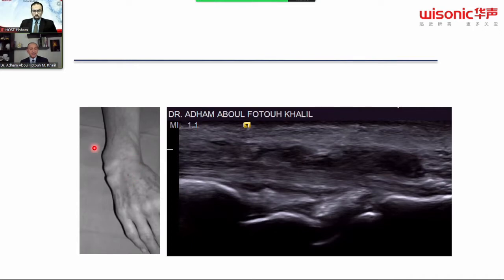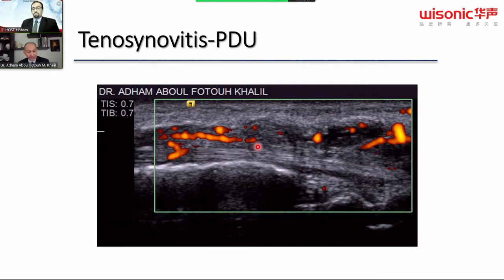This is a patient who might have chronic synovial proliferation of the hands and wrists, and you can see some deformities and some swelling clinically, but it's quite difficult to differentiate which element is taking the major affection, because you can see some changes in the joints, but the major change was in the tendon. You can decide with the ultrasound which tendon this is, which group, and how you can interfere inside the tendon, and some starting tendon erosion here.